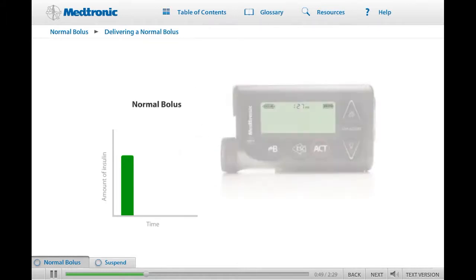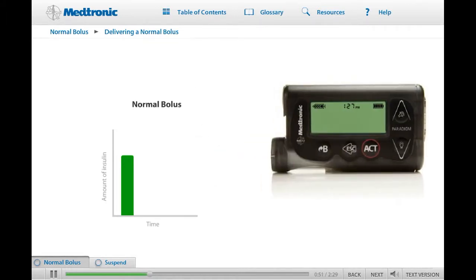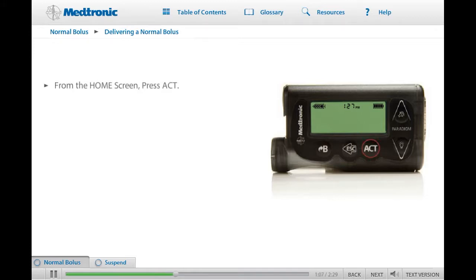When you program your pump to give a normal bolus, insulin will start delivering as soon as you press the Act button. The length of time it takes to complete each bolus will depend on the amount of insulin that is being given. Let's walk through the basic steps on how to program a normal bolus. From the home screen, press Act to go to the main menu. Bolus should be highlighted.